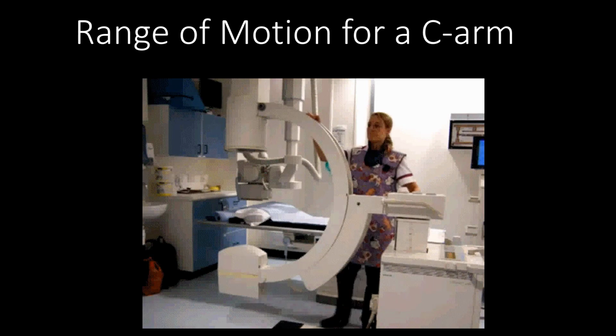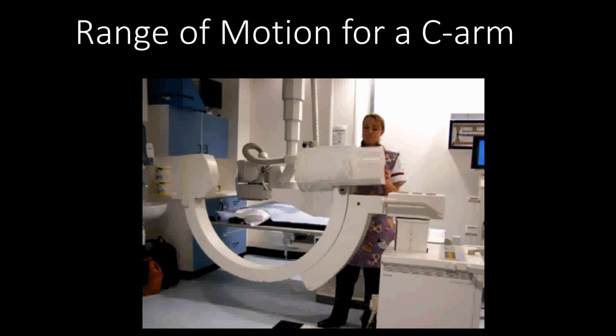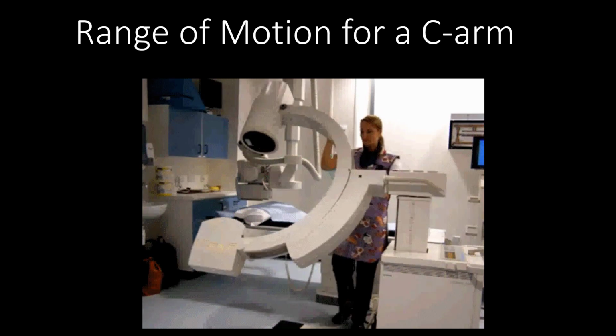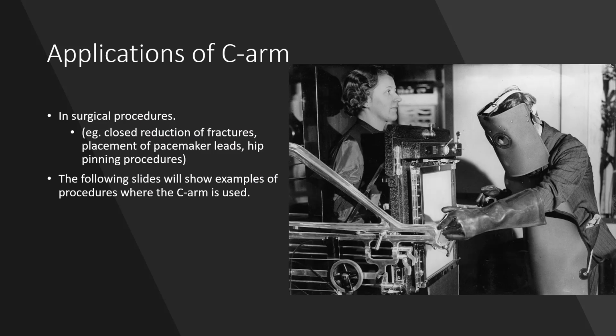At times you may feel with the environment that you're working in, especially if you have a small room, moving the C-arm equipment and the X-ray equipment is similar to trying to back a semi-truck into the loading dock. I mean, you got to know how to drive that equipment. So we need to take a look at the range of motion for a C-arm, which is different than the range of motion for an overhead X-ray tube crane. You also need to understand how the procedure is performed that you're imaging so that you can place the equipment correctly and utilize the equipment as needed as part of the operating procedure.